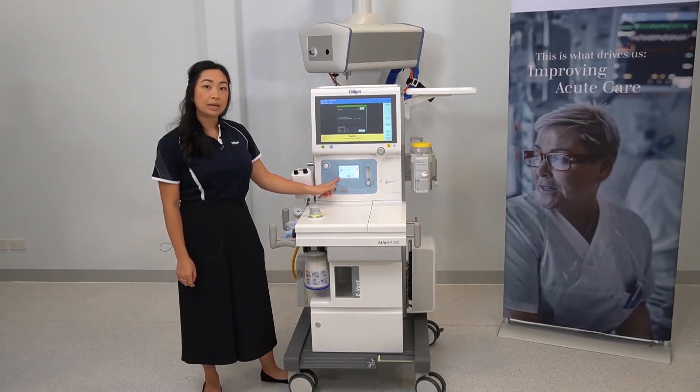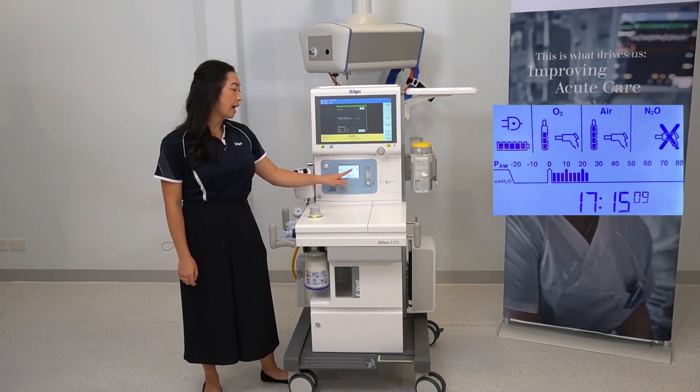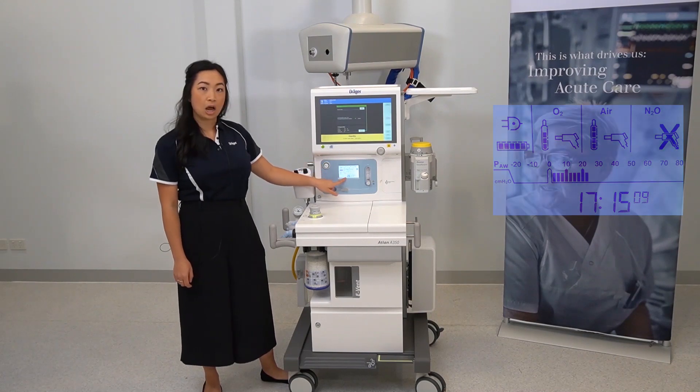This screen will give you an indication of your power supply, your gas supply, and has an electronic airway pressure gauge and your time.